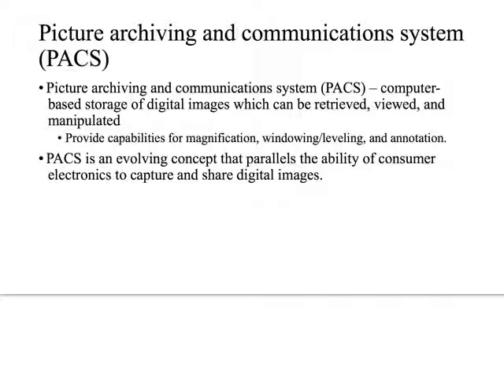The reason that I can't do that is not limited to consumer electronics. It's limited to the obvious reason that it's not a good idea to run a CT machine off of a cell phone, right? Because anyone could then have access to it, perhaps, and be running all these radiation-producing machines from perhaps a pirate network or something like that, as well as the protection of patient information. So the one thing that will limit the development of PACS will be the privacy settings required by these networks, firewalls, and evolving information encryption and compression, stuff like that.